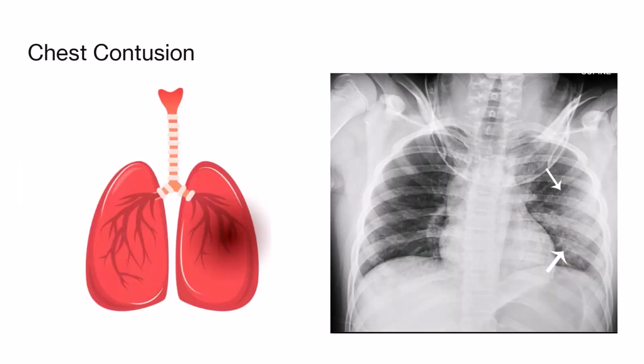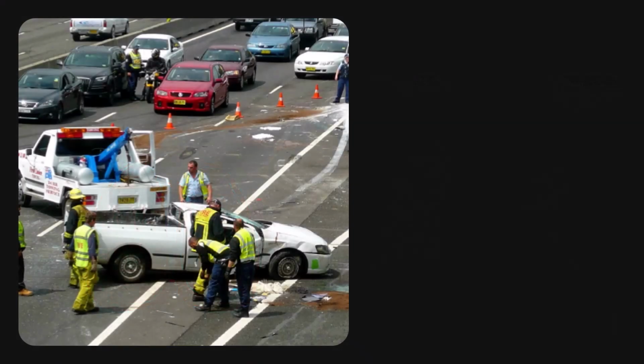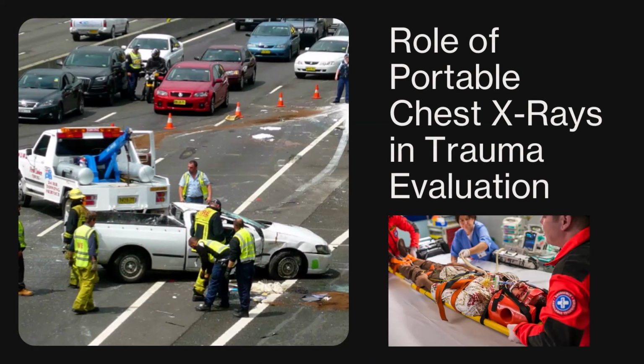When taking your radiograph, technique is extremely important, and so is positioning when looking for a chest contusion. Portable chest x-rays are indispensable tools in trauma settings, allowing rapid bedside imaging without moving unstable patients. They provide crucial information for immediate clinical decisions.